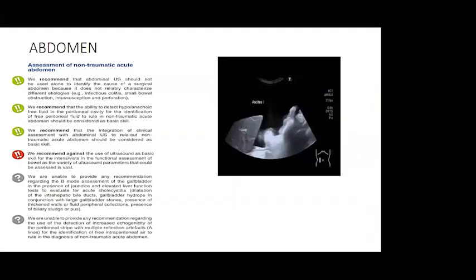Coming penultimately to the abdomen. Abdomen is a Pandora's box. It has a lot of limitations in use, because in any acute abdomen, gaseous distension will obscure the findings. The issue with the abdomen here is abdominal pathologies like intestinal obstructions, leaks, and perforations, which you cannot diagnose.